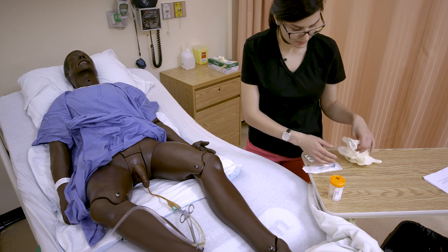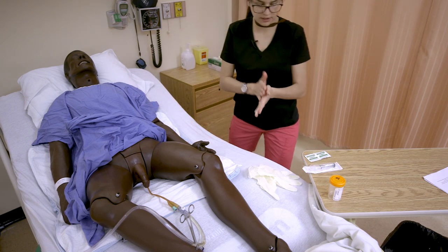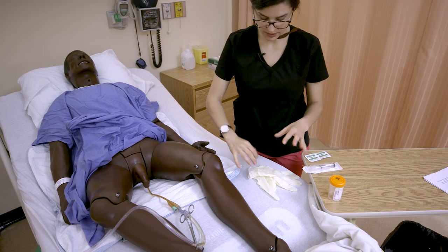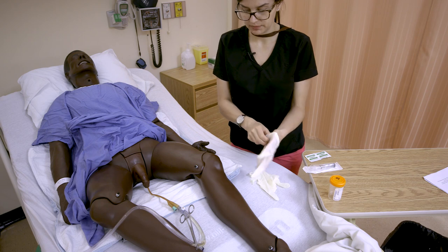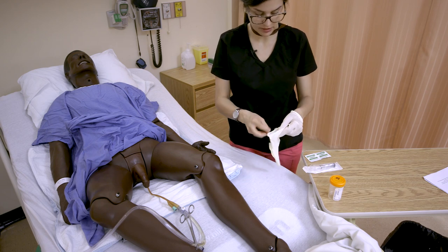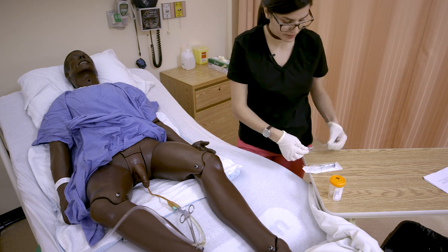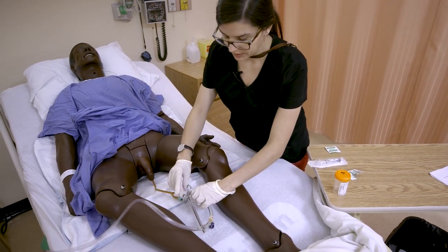We'll prep our supplies and clean our hands. When you start, the first thing you're going to do is swab the port, because that's where we're going to hook up our Luer-lock syringe. Swab that port for 30 seconds and then let it dry.